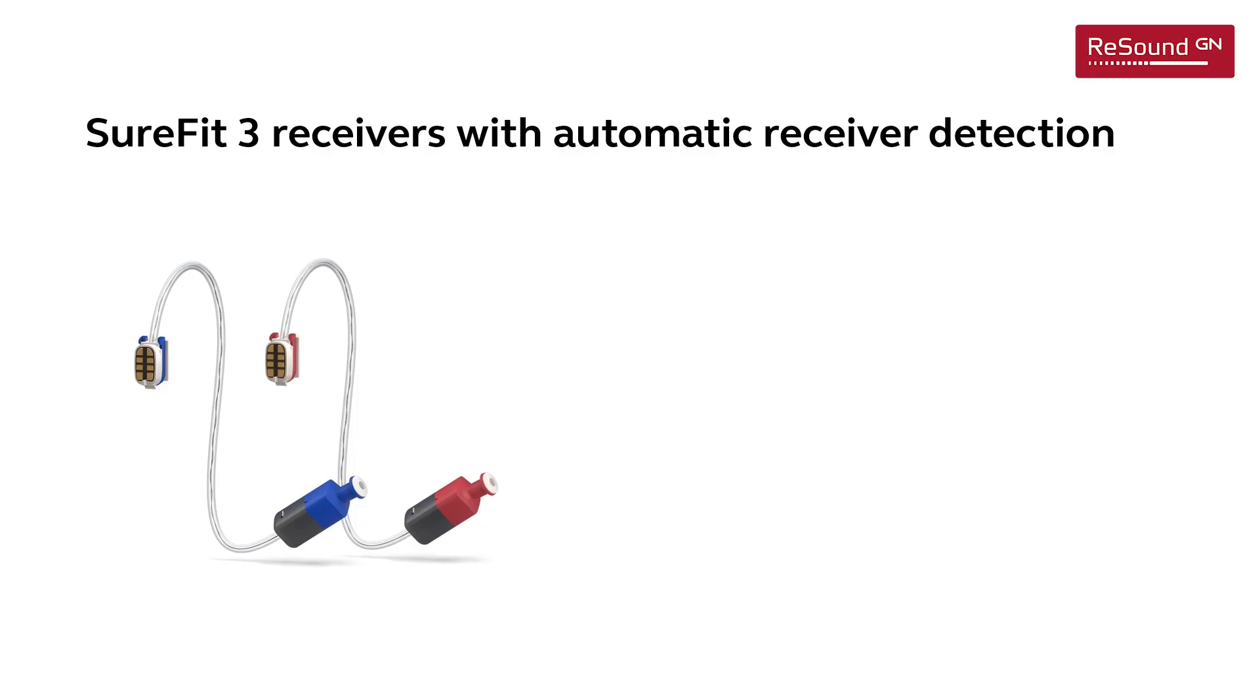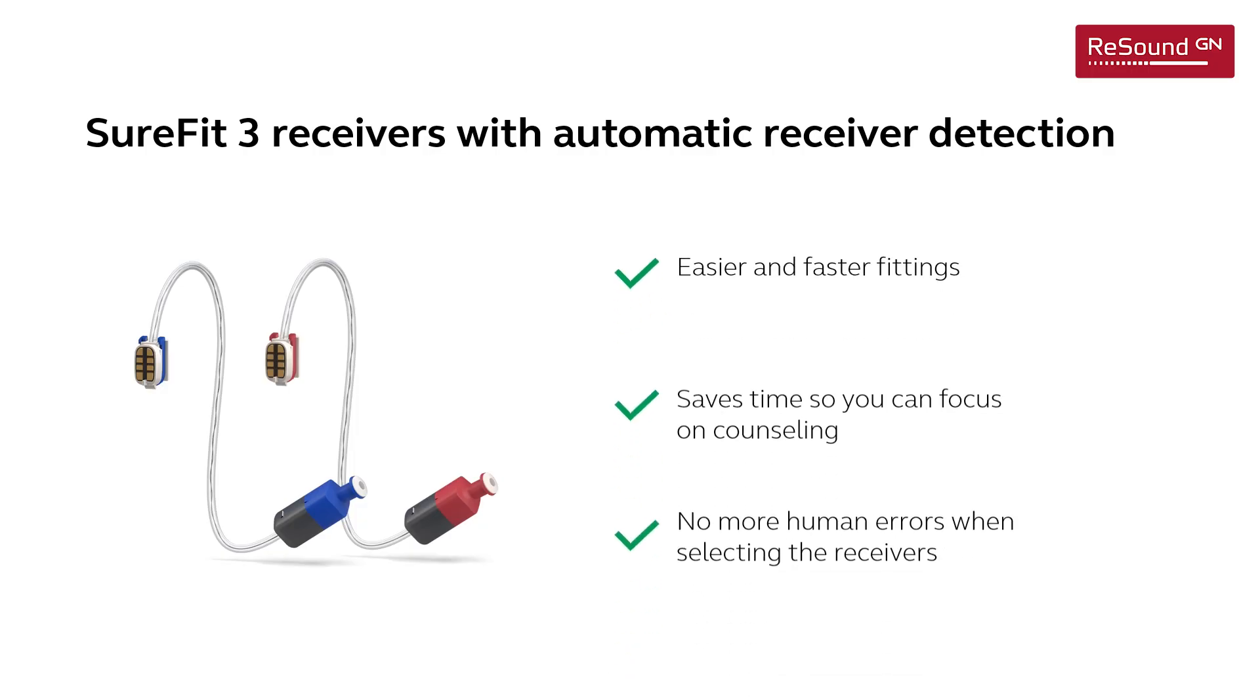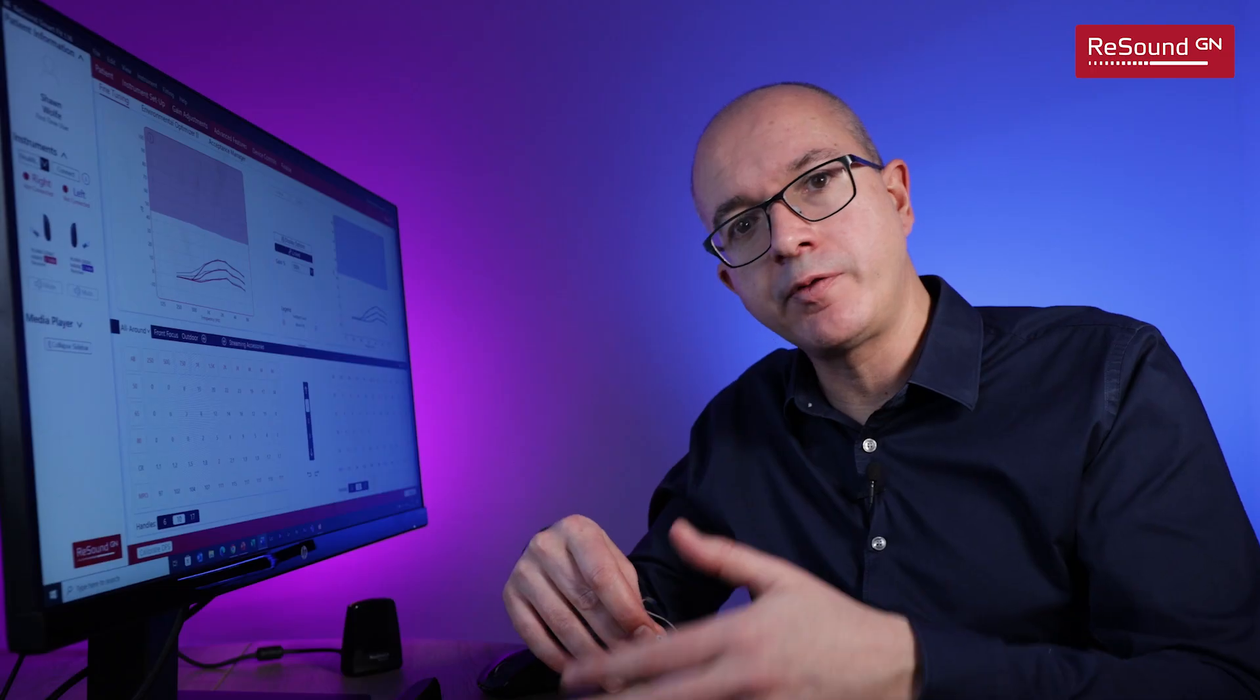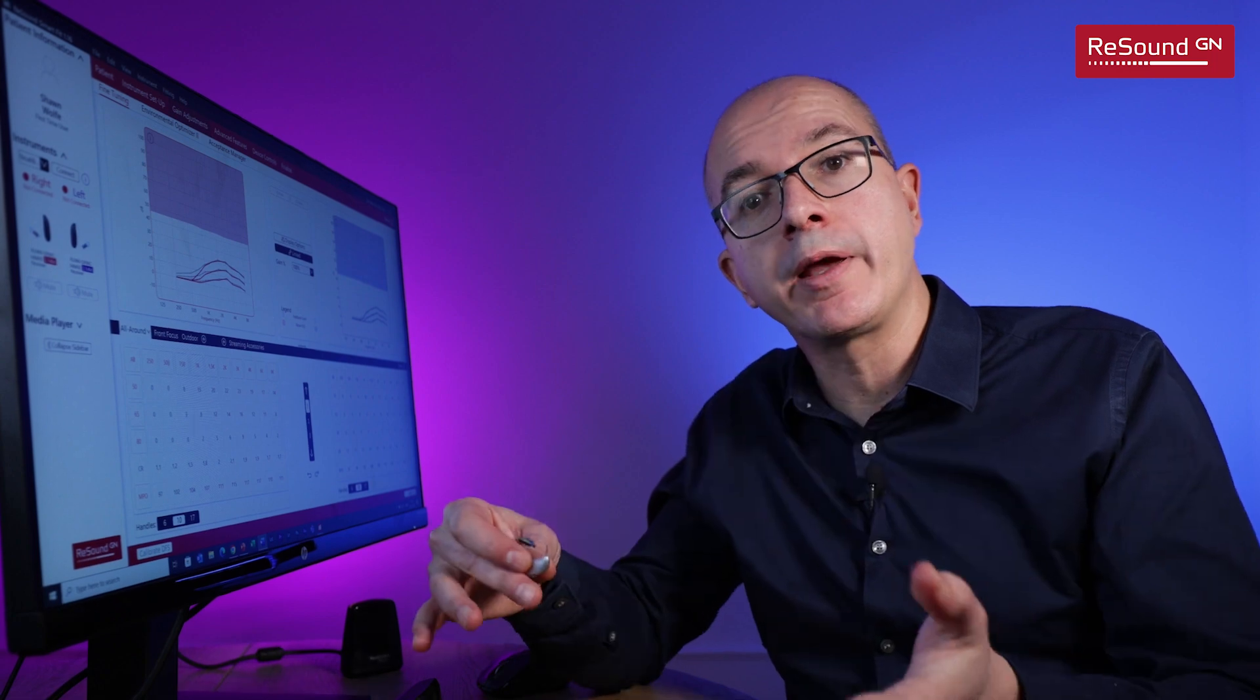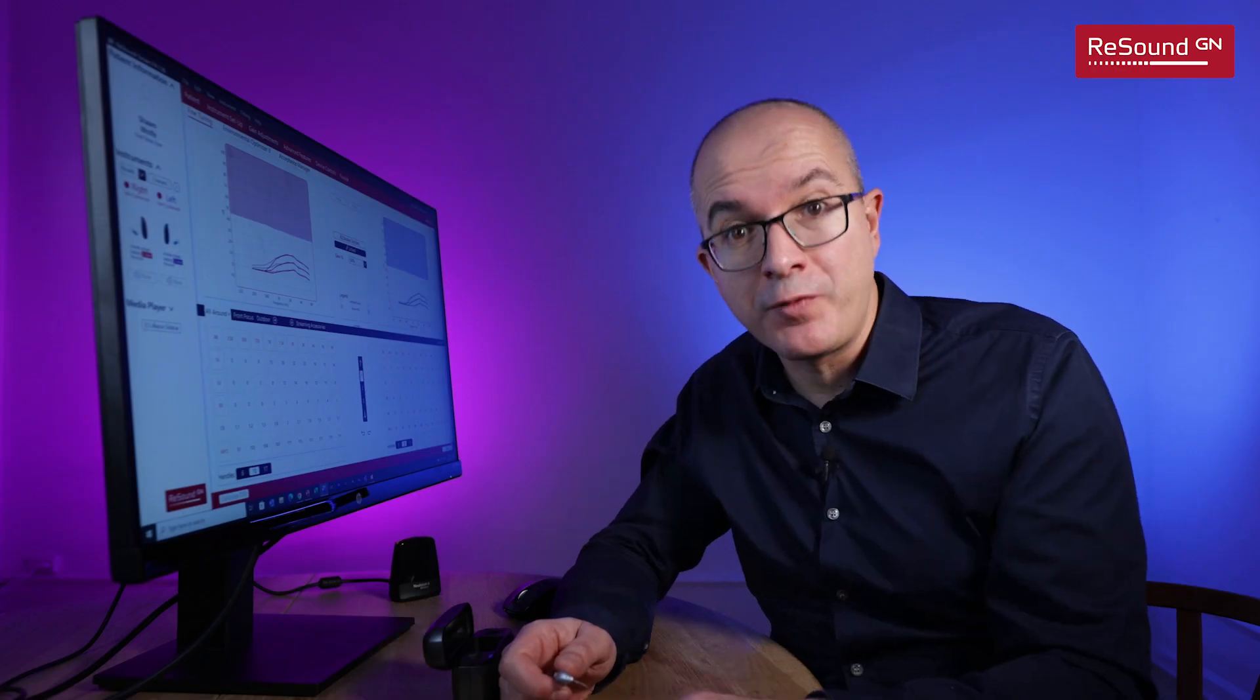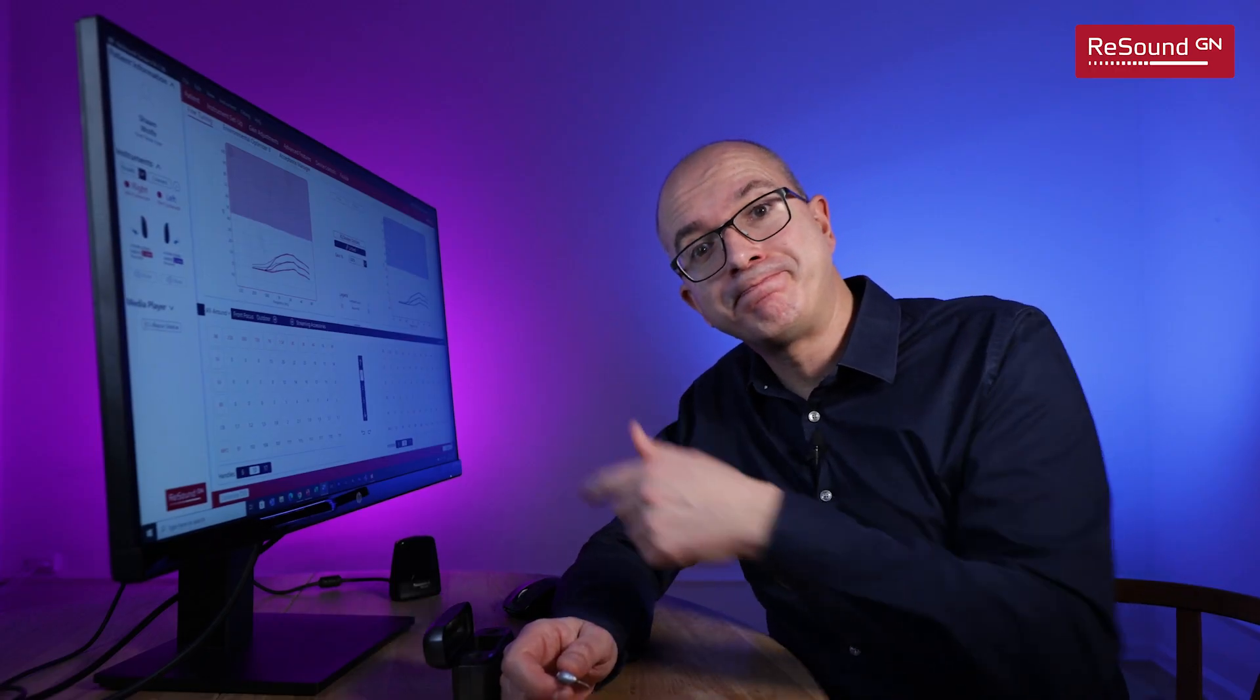And for this example I've chosen a pair of medium power receivers. These are the SureFit 3 receivers and I really like them because these receivers are automatically detected by the fitting software, which will save you a lot of time and will make your daily fittings so much easier. Let's open the fitting software.